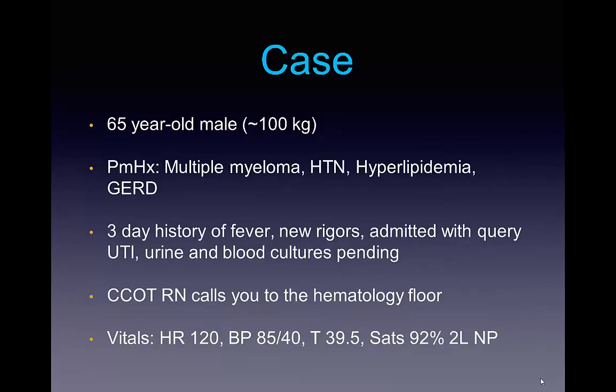At this point, you can go ahead and engage in laryngoscopy or deliver some BVM breaths if the patient is not satting adequately. At this point, you're going to make sure you've already done some pre-oxygenation for a minimum of 3 minutes, and now you're into laryngoscopy. As mentioned, careful, direct, progressive approach into the airway. You're going to have your airway adjuncts, for example, a smaller size tube, an LMA, and a video laryngoscope. And you're going to try with direct laryngoscopy.